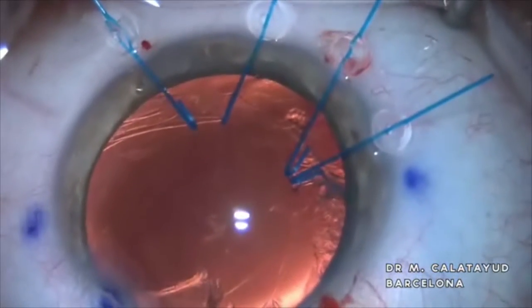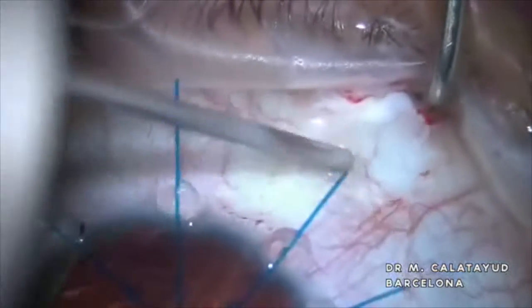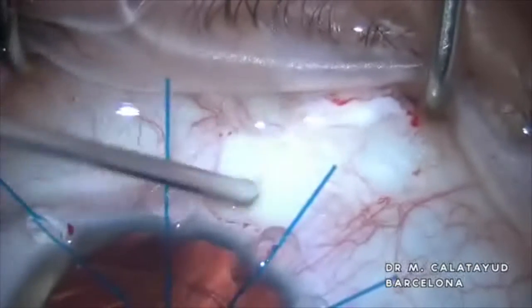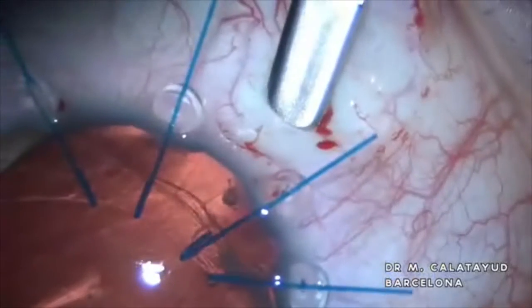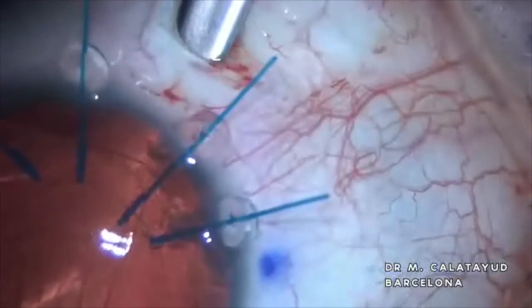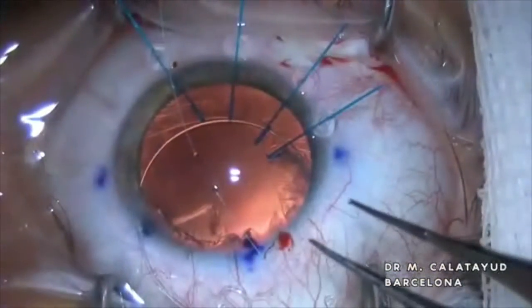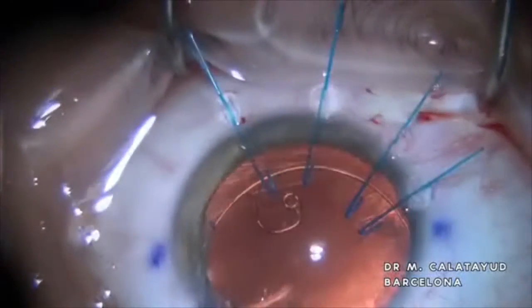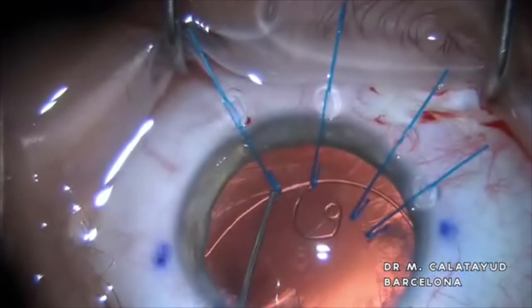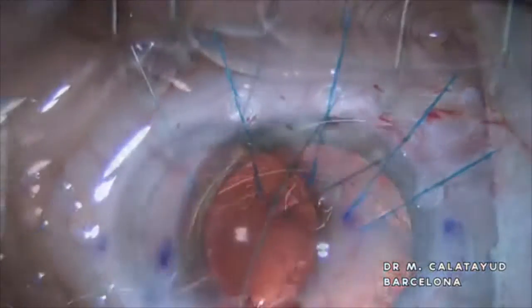Once we have an almost clear crystalline bag, we fill the entire chamber with a viscoelastic and then create a groove or a square tunnel between 2 and 3 mm from the limbus to suture the Cionni capsular tension ring. We pass one of the needles through the hole and then introduce softly the Cionni ring into the back, taking care that the hole is over the anterior capsule.